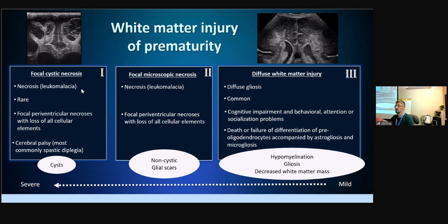Gotcha. And then, is there an internal control you use for the echogenicity? Because sometimes it's really hard to tell. There's a classification system by Bravo et al. They recommend comparing with the choroid plexus. If it is greater than the choroid plexus, it's abnormal. But in real life, it doesn't work. It's not that easy. Yeah, I will show you some examples.